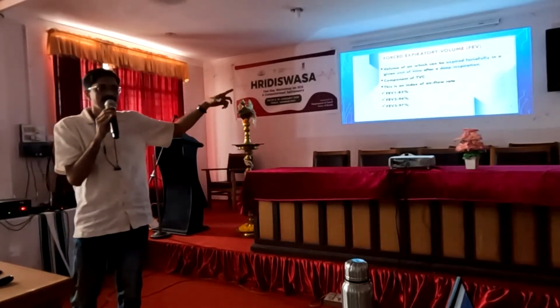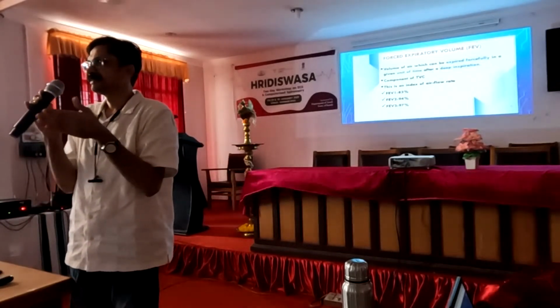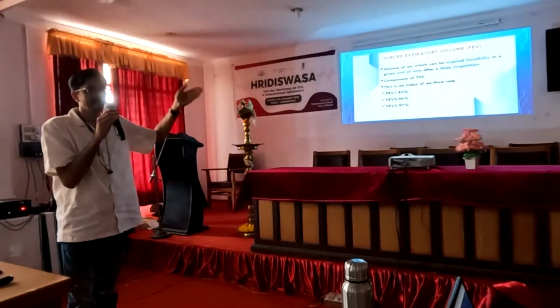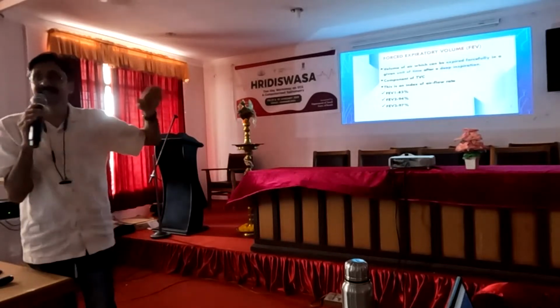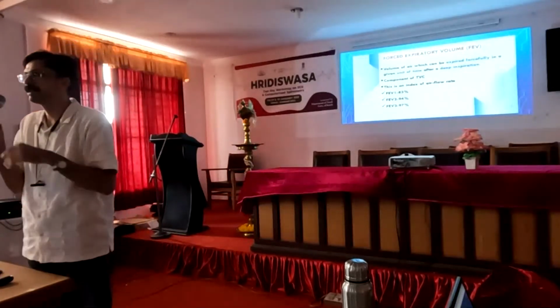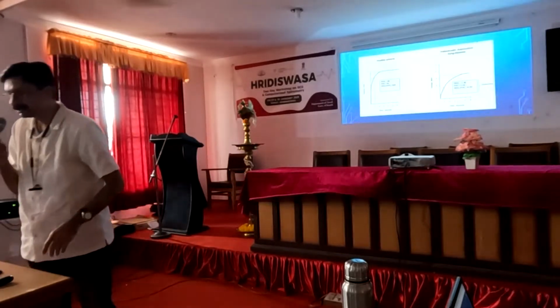FEV2, at the end of the second second, 94% of the vital capacity will be expired. And for FEV3, 97 up to 100% of the volume of air will be breathed out. Clear? So it is important.